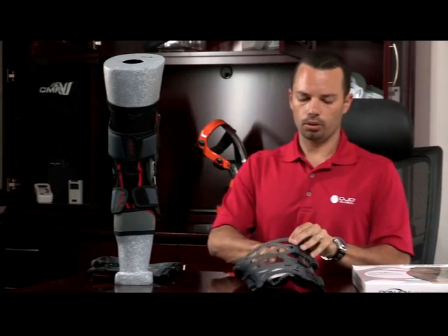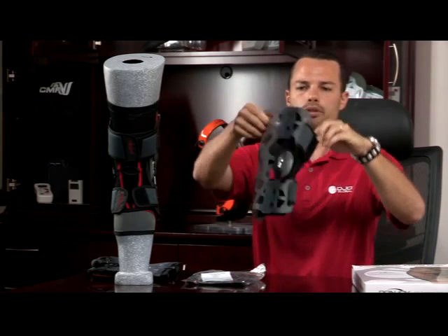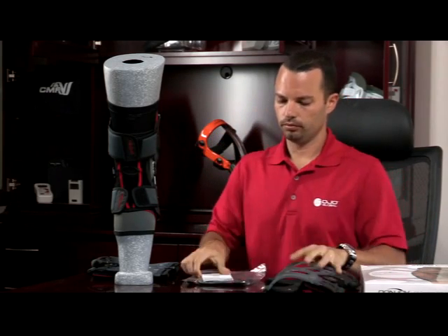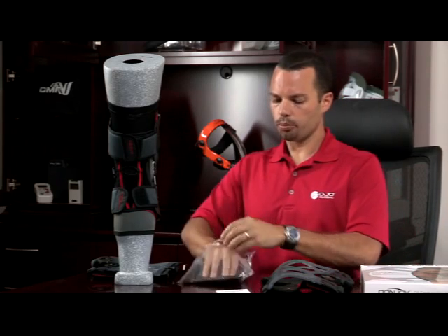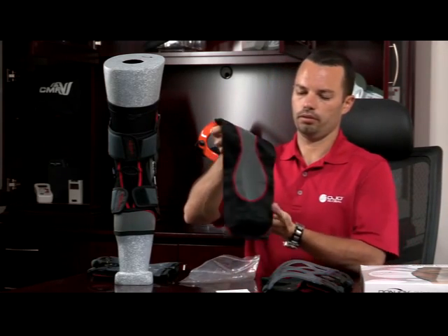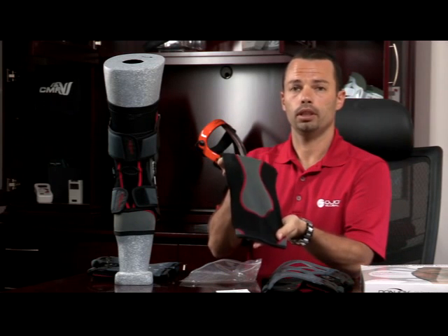Every box will come with the web and the back pad, which is the entire brace, the instruction manual, and each brace comes with its own under sleeve. You can wear the under sleeve to make it a little more comfortable and snug fit.